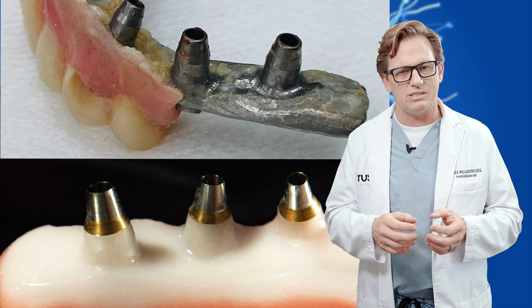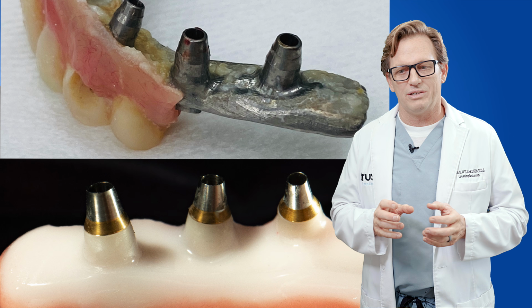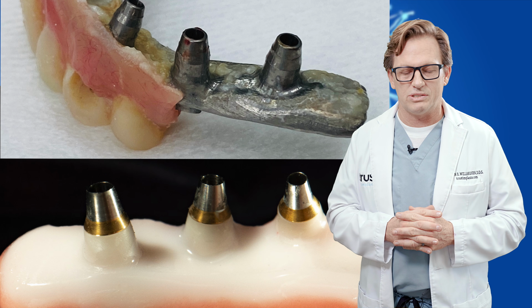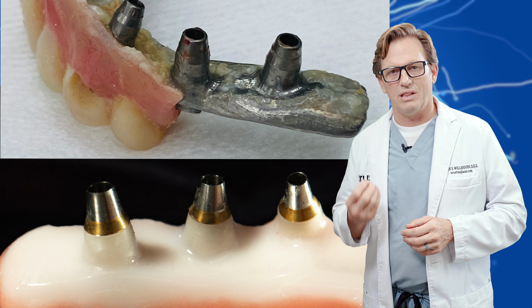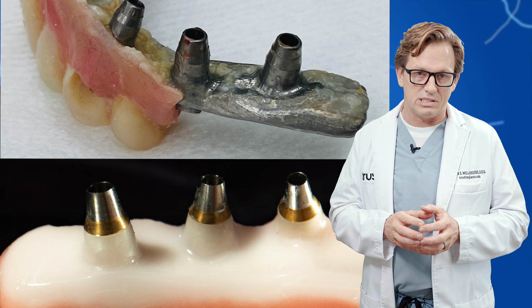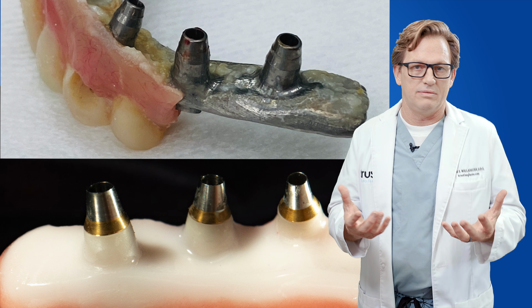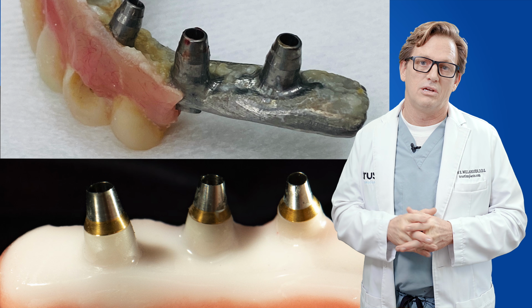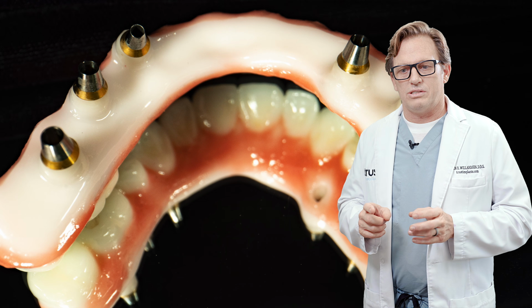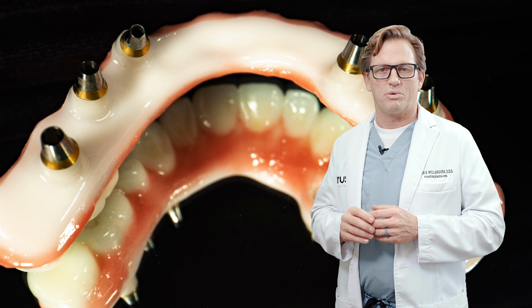Titanium a little bit less, or whatever this metal is, a little less, but zirconia is much, much less than either. And so that's another reason why I like to use zirconia, because it does not adhere bacteria, plaque, or any of the things that can cause problems with your implants or the bridge itself. So let's get into the details of the prosthetics.